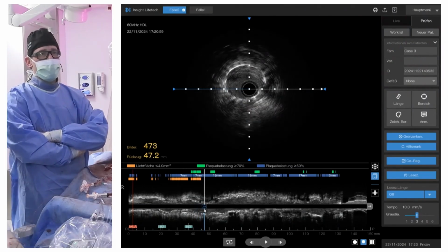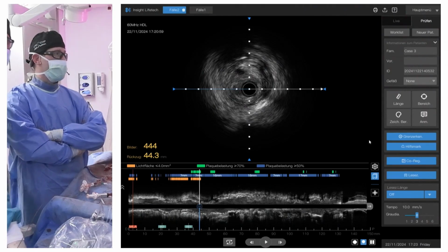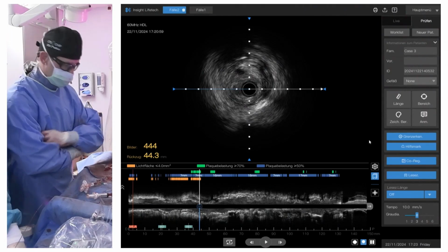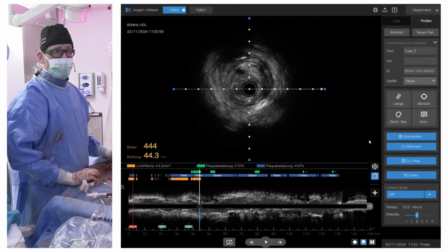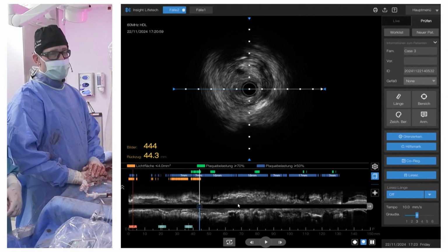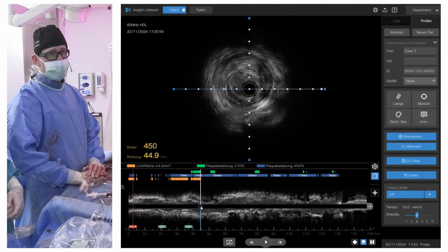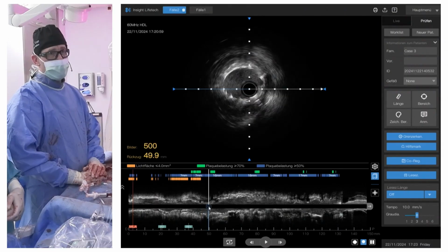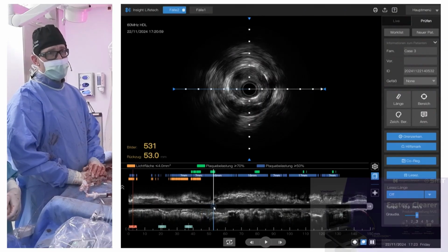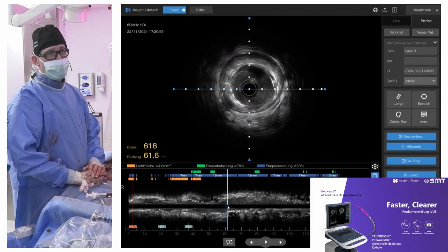Go further. Oh, go back again, please. So here I'm not entirely sure if there's maybe even a stent gap, right? Which is on the proximal PD, close to the entrance into the distal RCA. Further. And then there's the next stent part. And now we're going to see the bifurcation in a sec.